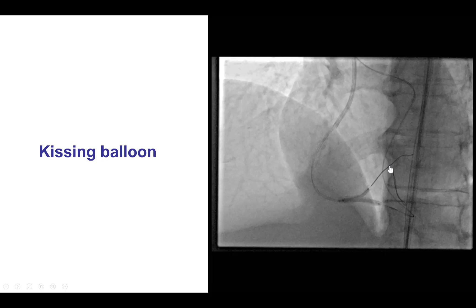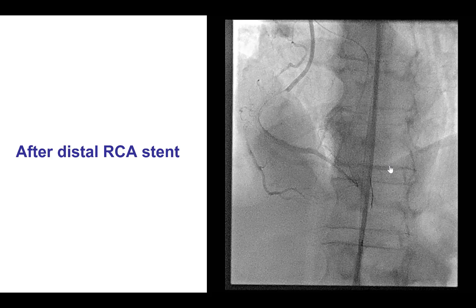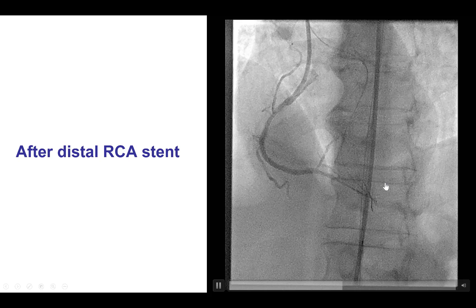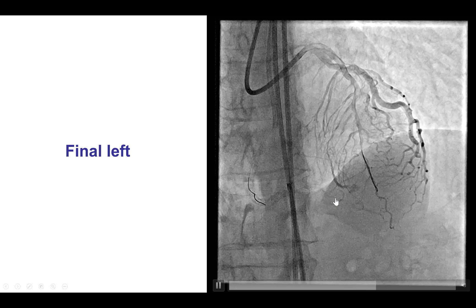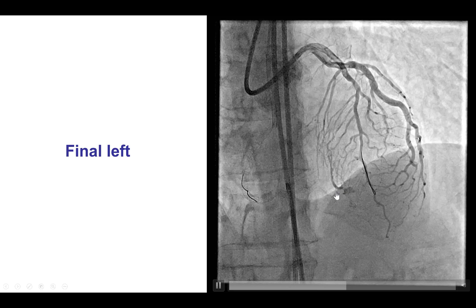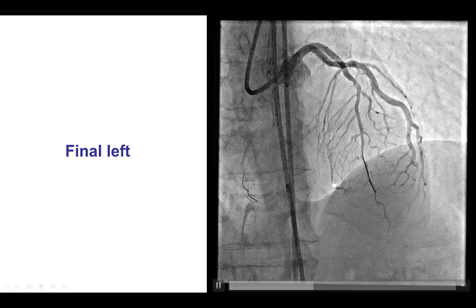It is important not to lose a major branch like this during CTO recanalization. After the kissing balloon inflation and placing an additional stent distally, we had a nice final result with TIMI flow in the right coronary artery. Final injection of the left coronary demonstrated some dissection and perforation of the first septal that we tried to cross with the microcatheter without success, but the other two septals are okay. This illustrates that if there's a lot of resistance to crossing a septal, it may be best to switch to a different septal rather than persist.